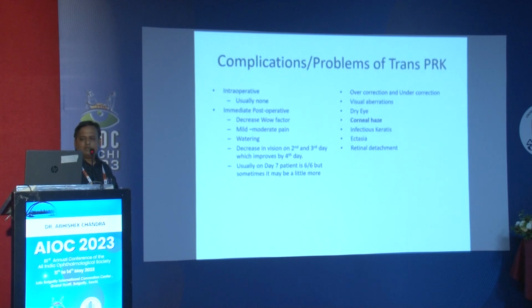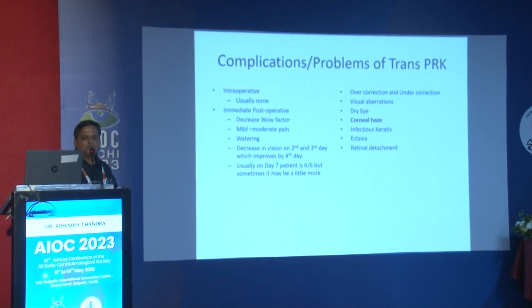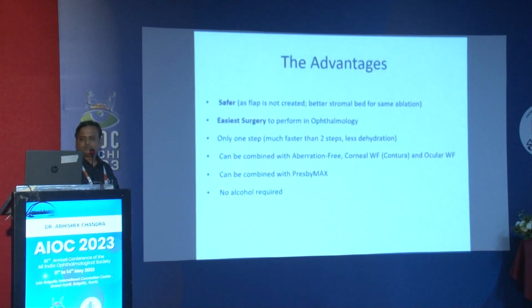So then there can be infectious keratitis, but it is much less as compared to a LASIK surgery. Ectasia is usually less because the stromal residual bed is much more in comparison to LASIK, and the chances of retinal detachment is much less.